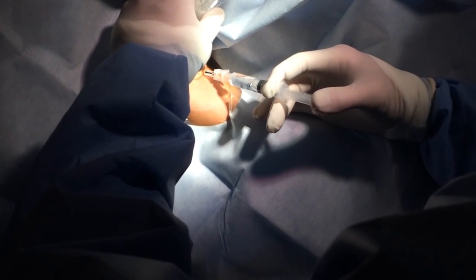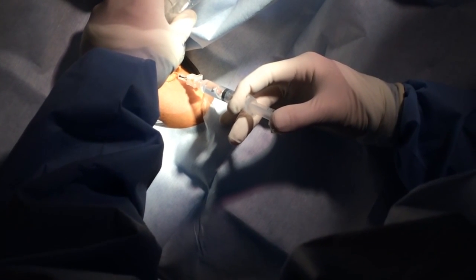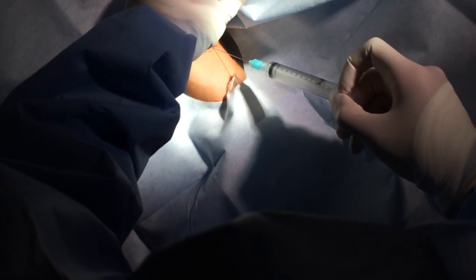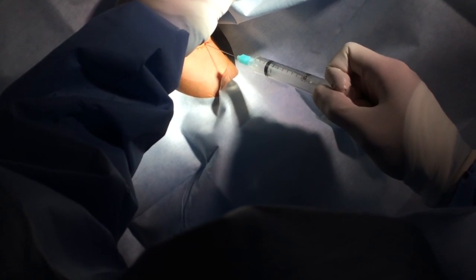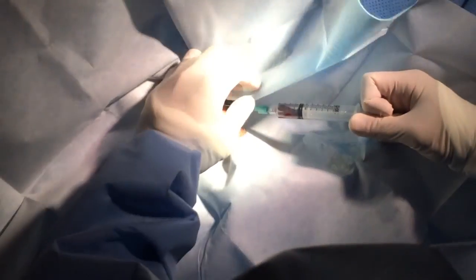All right, so Rory's injecting again with half of the lidocaine syringe. We're saving the other half for later when we actually do the dilation. There's the ultrasound. All right, here comes our nice big introducer needle. Looking on the ultrasound, and there it is. Nice flash. And there it's still going.